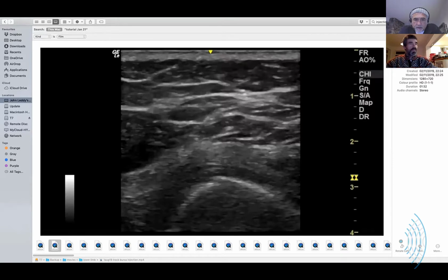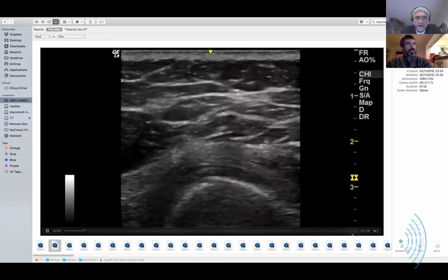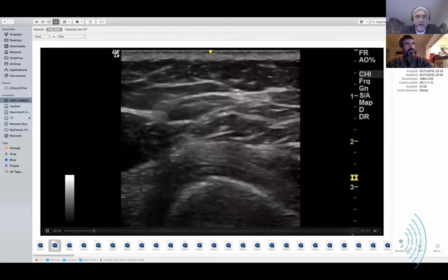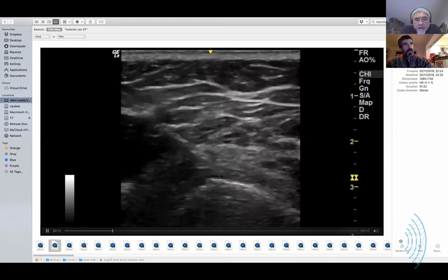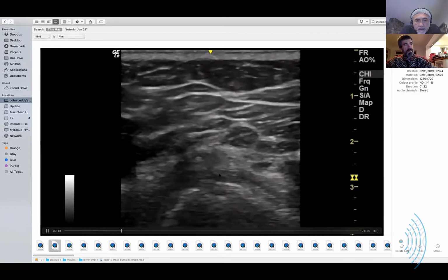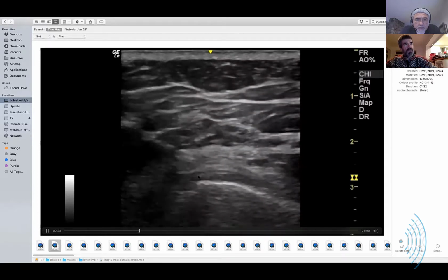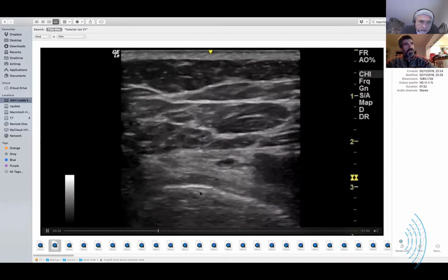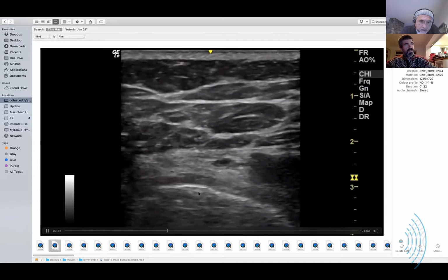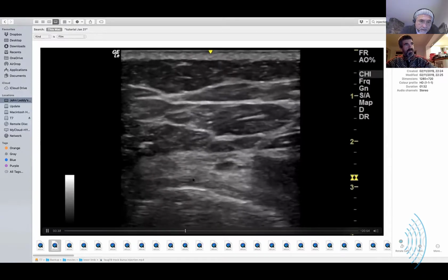So the question is whether I saw the needle. So this is one of the ones where it can be tricky. I'll say that because I haven't pre-reviewed these, so I don't know what I'm showing you. I'll drag this along, I think. Okay, I can see tissue responding to at least the friction of a needle going in. So yes, when you get down 3 or 4 centimeters, it can be tricky to see the needle tip, but hopefully when I deliver the medication, you should. Yeah, so I can see it going there.